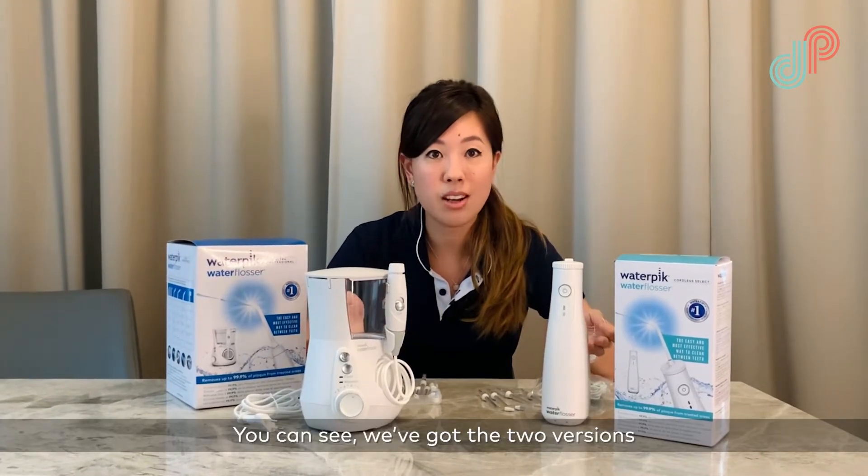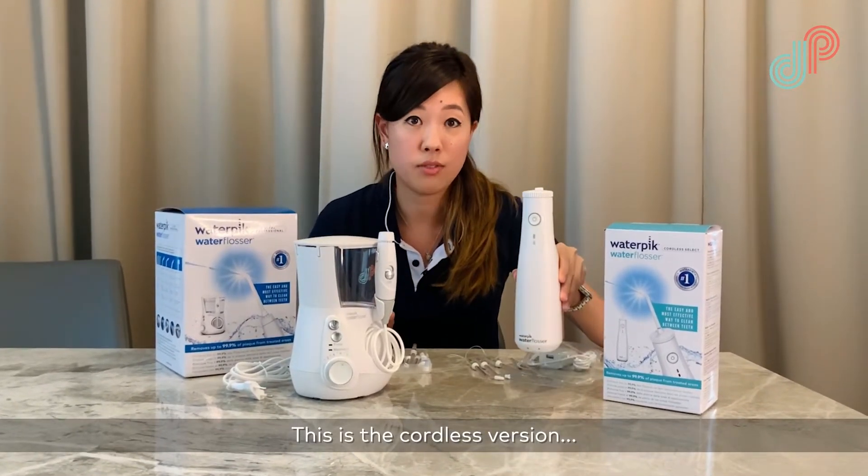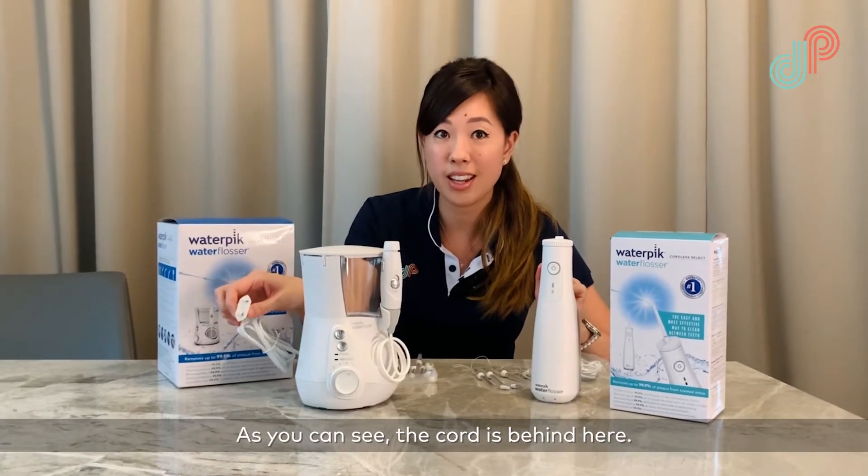You can see we've got the two versions in front of me here. This is the cordless version and this is the corded version — as you can see the cord is behind here.